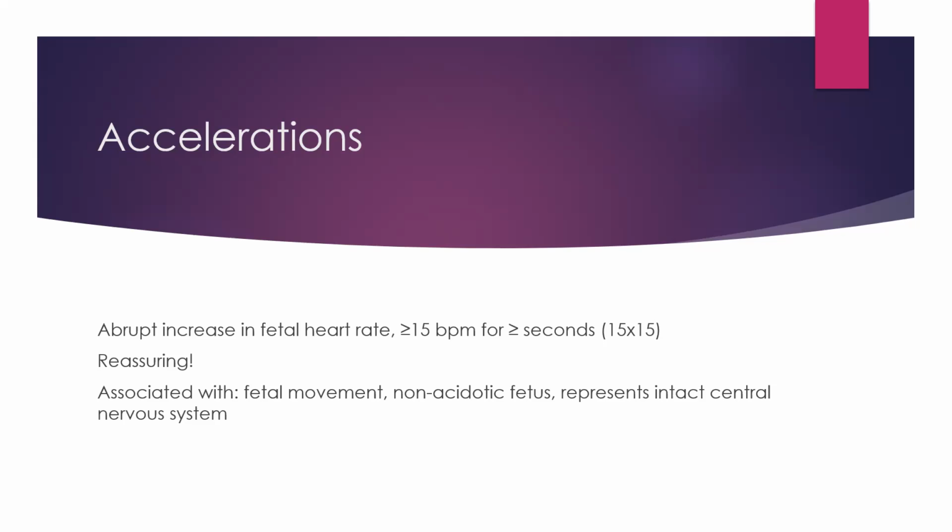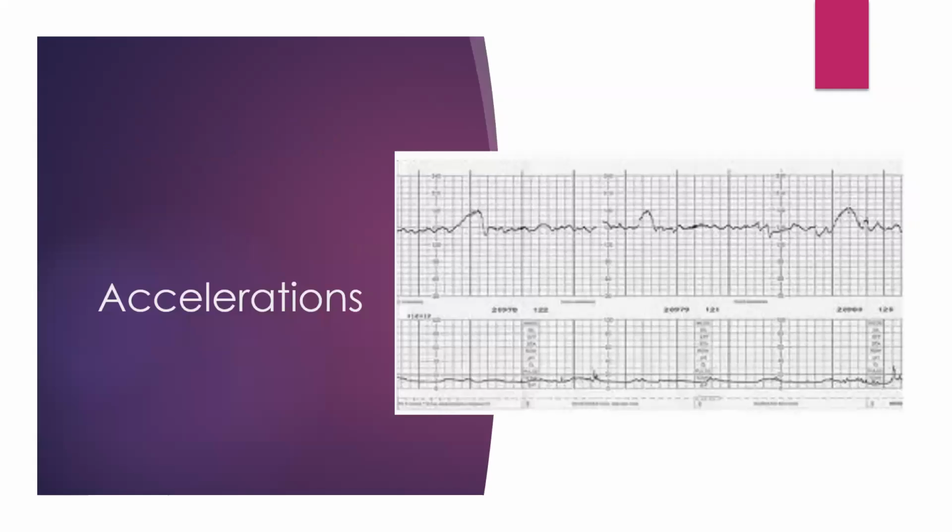And why are accelerations reassuring? Because they're associated with fetal movement. They're also associated with knowing that the fetus is not in an acidotic state. And accelerations represent an intact central nervous system. So here is an example of some beautiful accelerations.